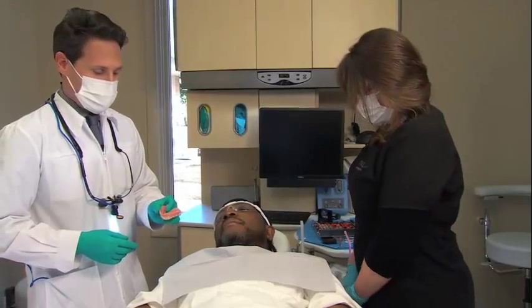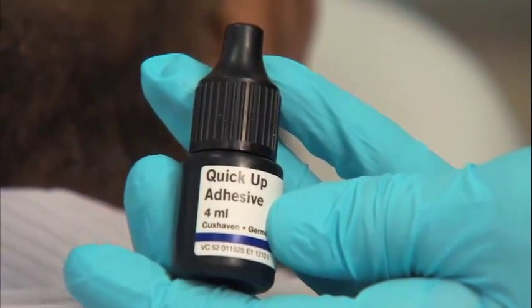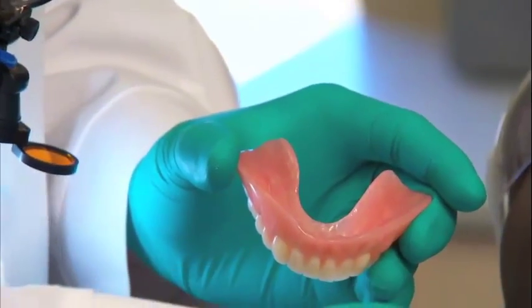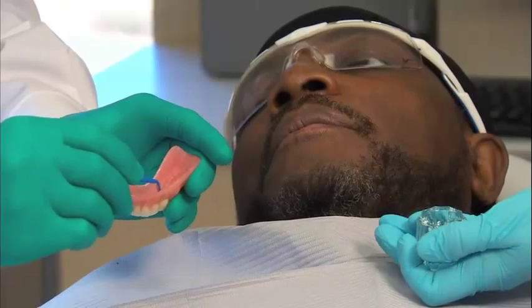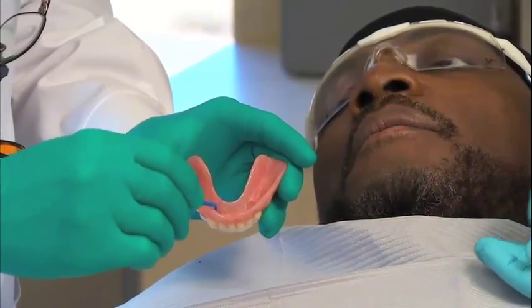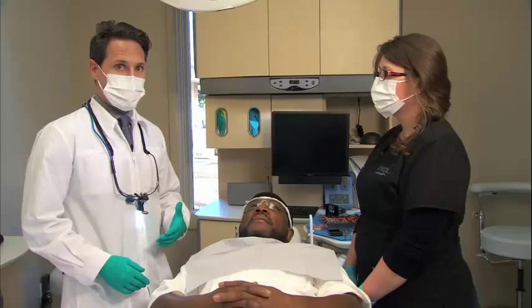Now it's time to prepare the denture for the composite QuickUp material. The kit includes a QuickUp adhesive — we're going to paint a little bit on the internal surface of the denture. You only need one or two drops and that will be adequate. These brushes are included in the kit as well. The QuickUp kit is an all-inclusive attachment system for implant dentures. As you can see, I have not drilled any vent holes, which saves a lot of time. We'll let the adhesive sit for a minute — it acts as the bond between the acrylic of the denture and the pink self-curing composite of the QuickUp material.